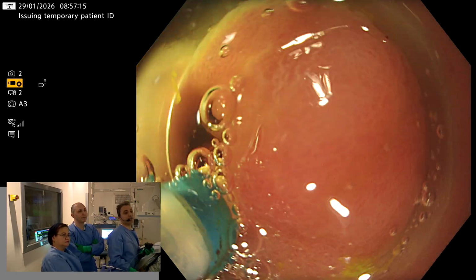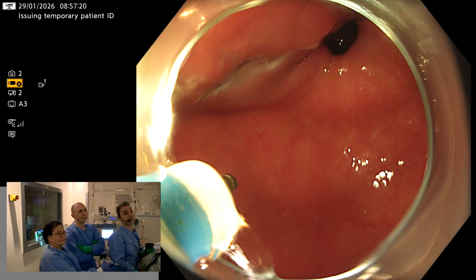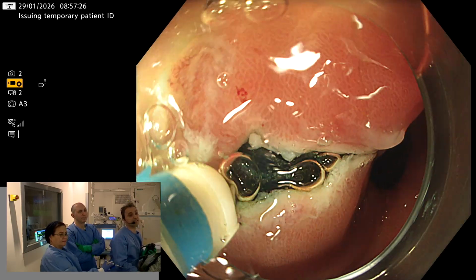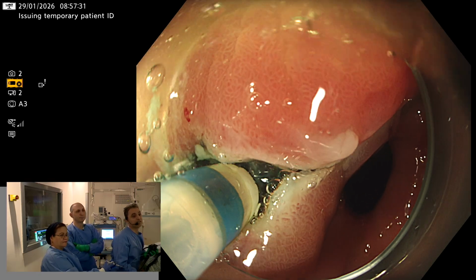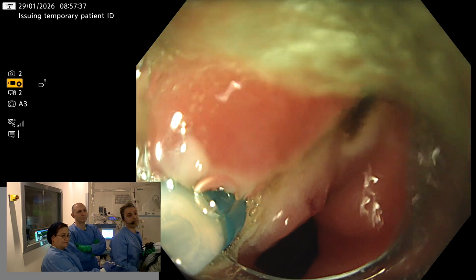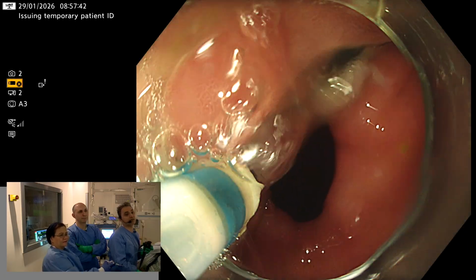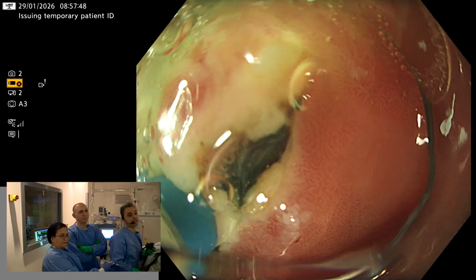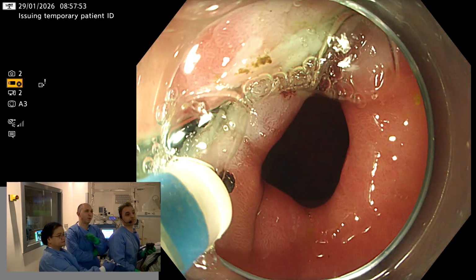Then I go on the same line tangentially, and in short position I make some trimming, cutting the muscularis mucosa, because the key of good ESD is good incision and good trimming. So I place the white ceramic tip inside, below the mucosal flap, because I don't want to burn my mucosal flap, and I dissect the muscularis mucosa and remnant of submucosal tissue, and I coagulate by forced coagulation, and I make the muscle to be exposed. So the trimming is done by the forced coagulation.